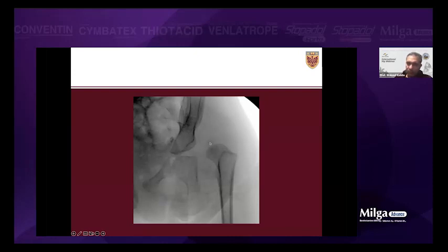I'm not a big fan of excising the capsule, but I do a strong suture at the part where I remove the labrum from here down there. So I do 1 suture from proximal to distal at the end. So I use 4 sutures for the capsulorrhaphy.